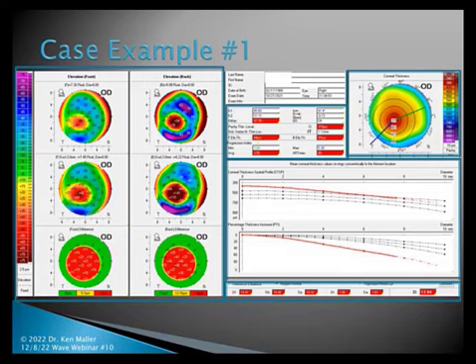What we're looking at over there is the deviation. The first one, the DT, is the deviation of the thickness on the front surface, the deviation on the back surface. I'm sorry, not thickness, just the deviation on the front surface and the back surface. The DP, DT, and DA are referring to the thickness changes, and they're all summarized through a regression analysis to that big D that's at the very end, indicating 13.94.